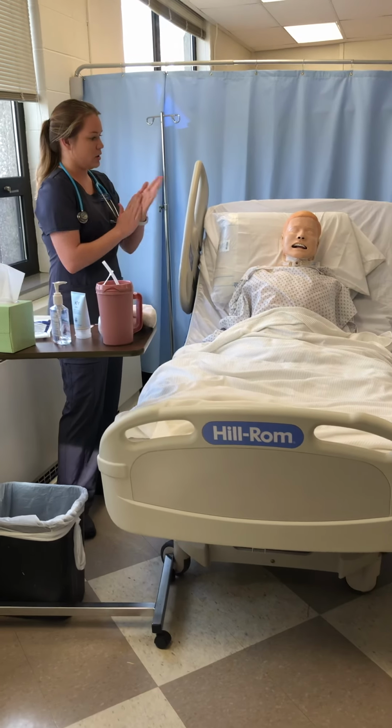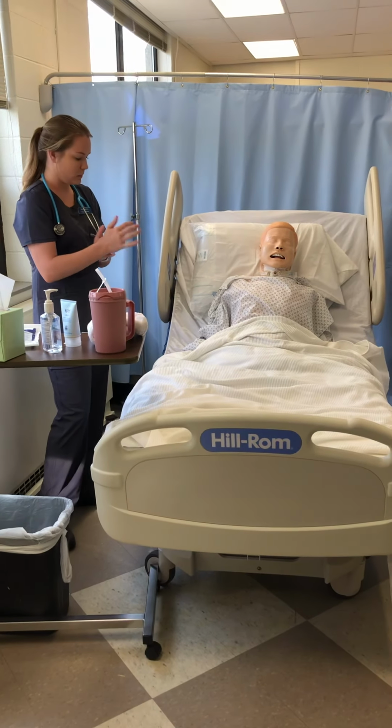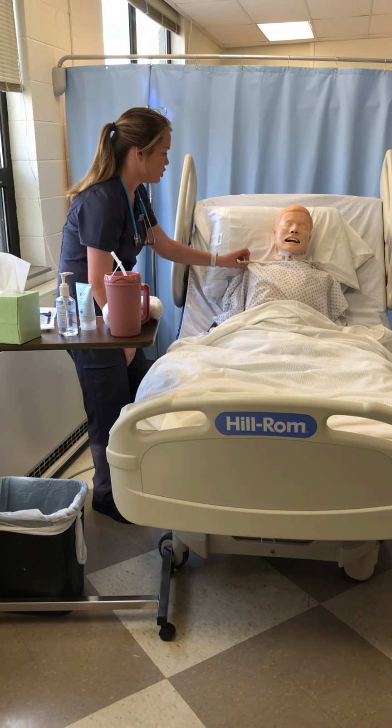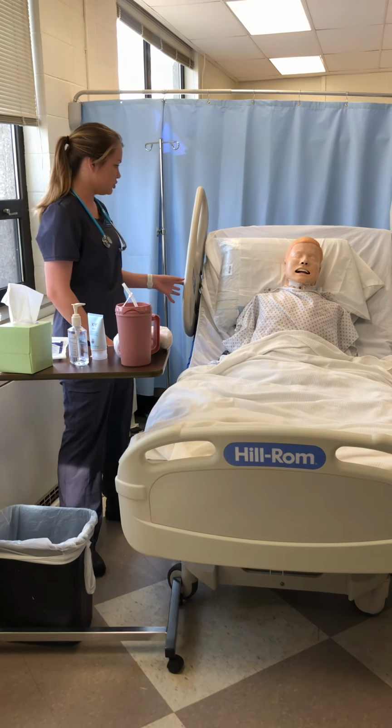Hi Mr. Bob, how are you? My name's Nicole. I'm going to be a student nurse today. Can you verify your name and date of birth? Great. Do you have any allergies? No. Good. Today we're going to insert an NG tube, okay?